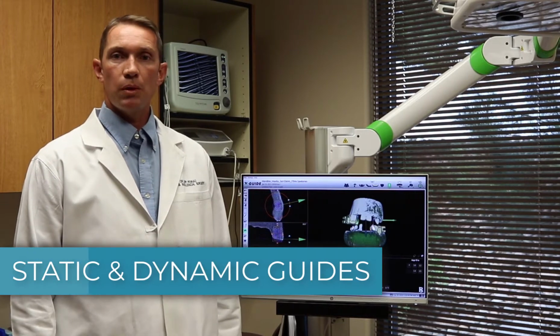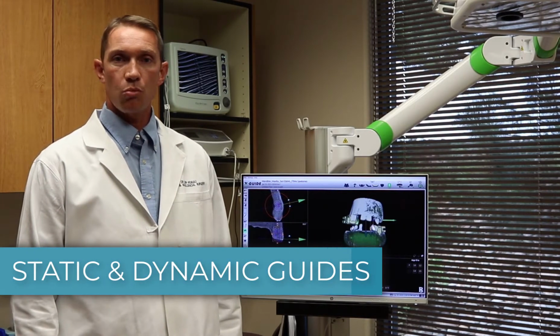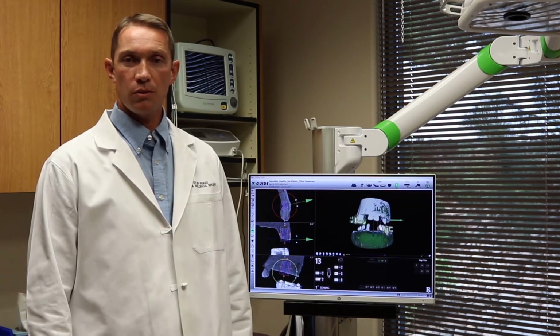A static guide is what people have been doing for probably the last 10 years or more. What we do is take an impression of your teeth, just like you would have at a dental office. We pour up a mold or a model in stone that represents your teeth. From that, we make a guide that is generally fabricated through the CT process, and the acrylic guide is milled or printed. That goes onto the teeth for the actual implant surgery and acts as a jig or a guide for the drill to go in to get the implant in the proper location. That works very well.